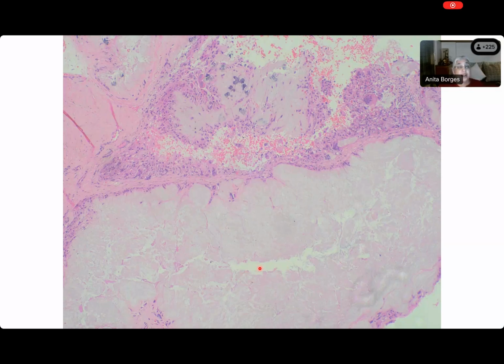This word floccular is very evocative of some kinds of depositions in the extracellular material, and one of them, which you see much more commonly than what you're seeing here, is amyloid. So amyloid is floccular depositions that you see. Now, once you know what floccules are, like a cloud, when you get a thickish cloud, that is a floccule. And if you think about it, that's what this brings to your mind. That is the meaning of the word evocative, or evokes.